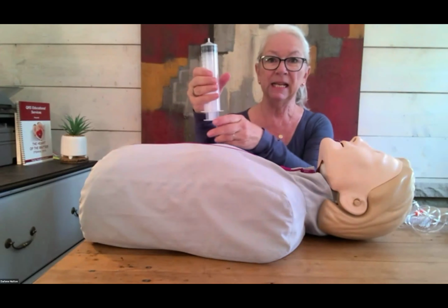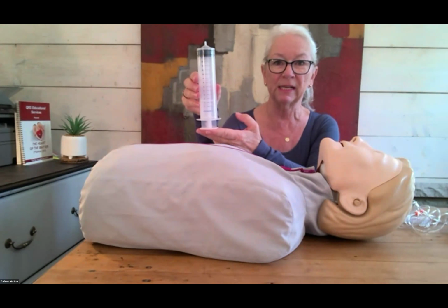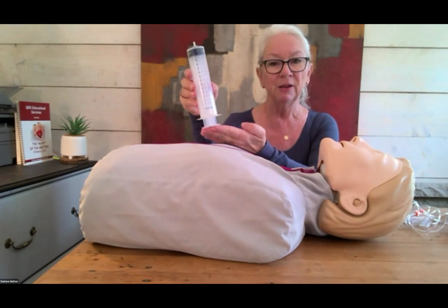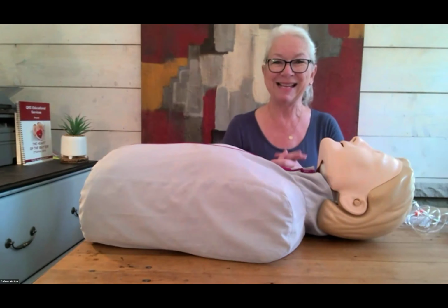For the King LT, which most of you do not have in your hospital as an airway option, this would be the syringe that is used. And King LTs are usually a pre-hospital type of advanced airway. So if you're in the emerge department, you may see a patient come in with a King LT in that situation. So those are the 5 S's.